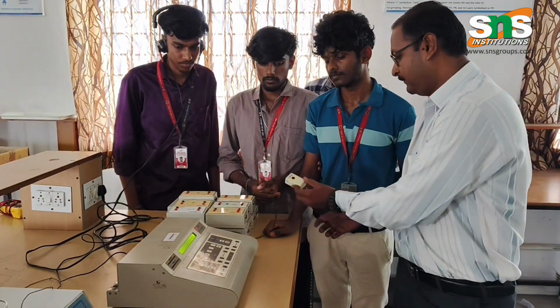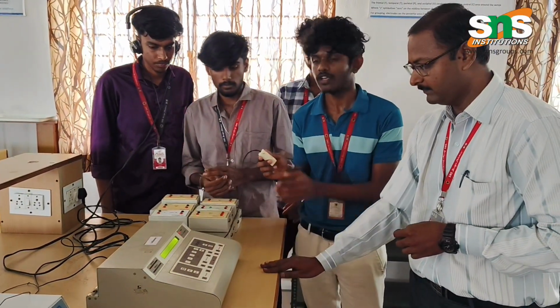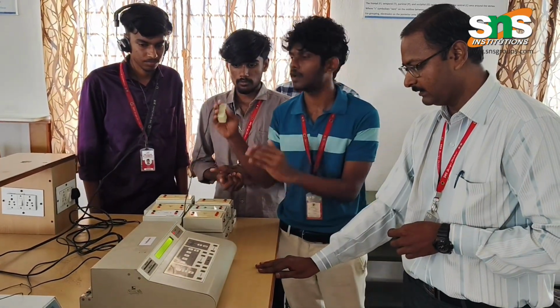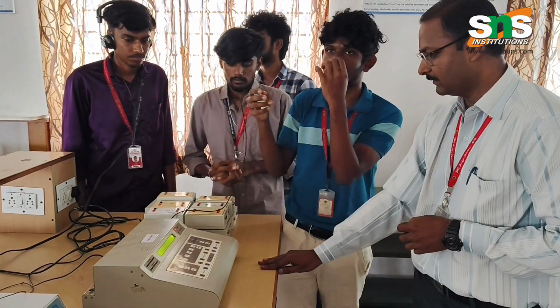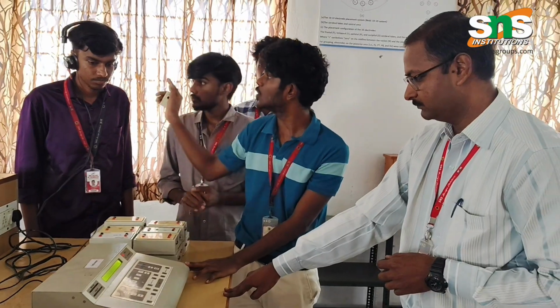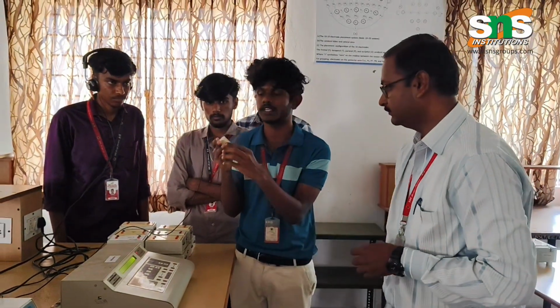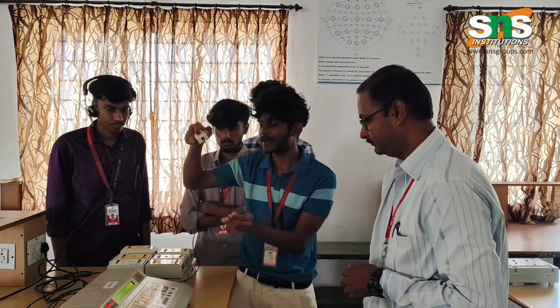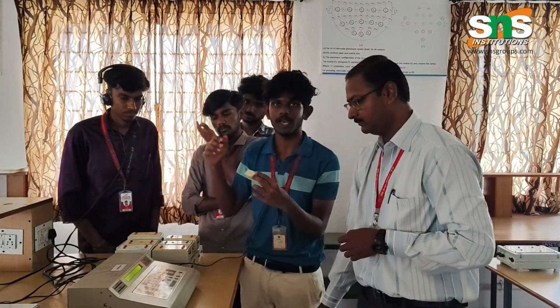Could you explain what this one is? This is used to tap. If we hear some noise, we could press this so that the person inside is separated first of all. The patient will be in a separate room fully covered with glass, so that they can't hear outer noises. Only the noise from this will go to the patient's ear. We have to check whether they are hearing or not, and for that we will give this. If the patient hears this, we can insert our finger, and if we press this, a response will come here. Okay, so this is what usually happens.